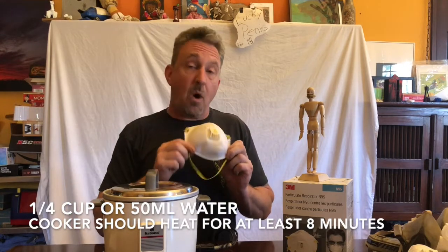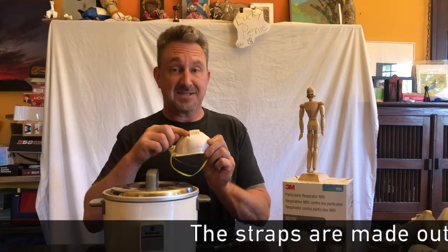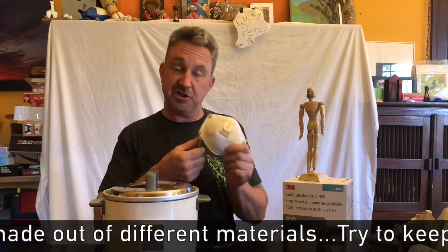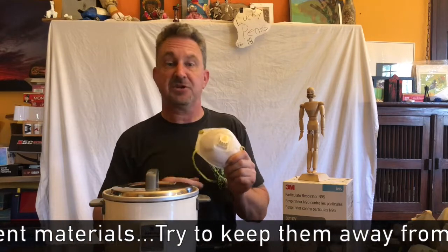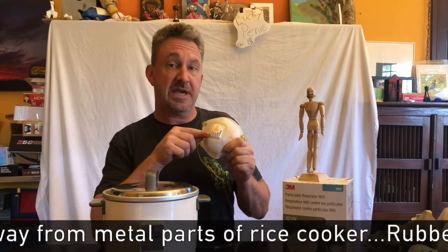The parts of this mask that won't like this process are the straps and a valve, possibly, if it has one. So if you are doing this form of sterilization, you need to inspect these very carefully to make sure they don't break. Make sure that the valve is still working the way it should be working.